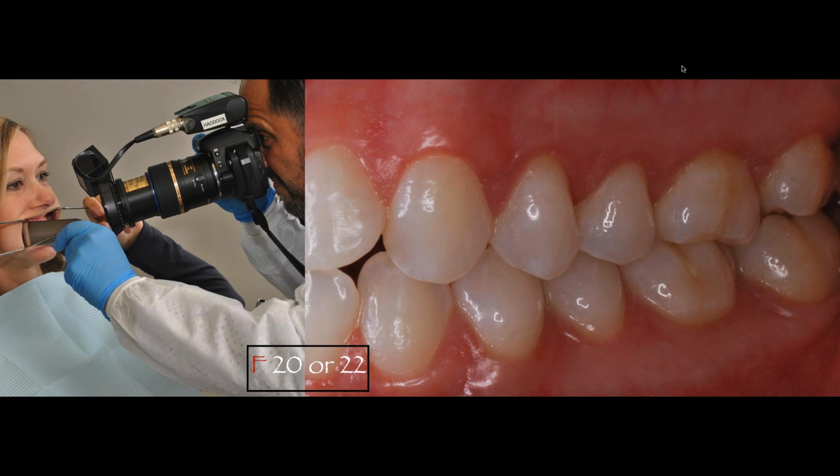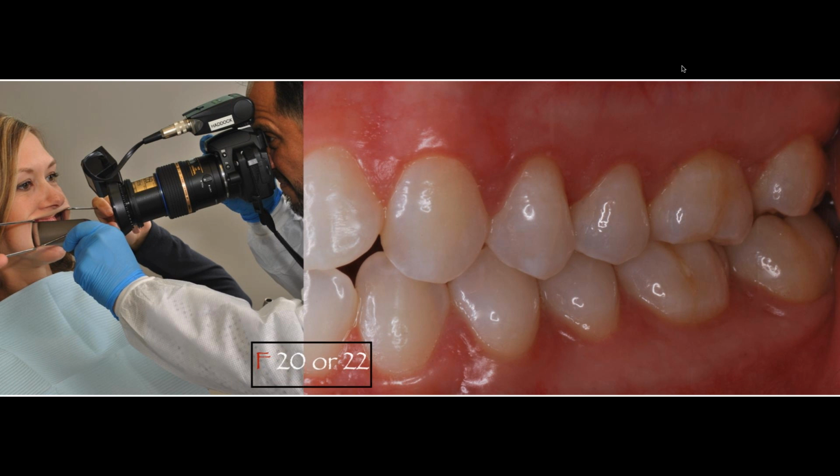You know exactly what you're aiming at and what you are trying to obtain as a final photo. So now I have the patient retracting both sides. The difference in this retraction technique is that on the left side of the patient, she's using the wide portion of the retractors. On the right side, on the other hand, she's using the narrow portion of the retractors. So this will let my mirror fit in better.